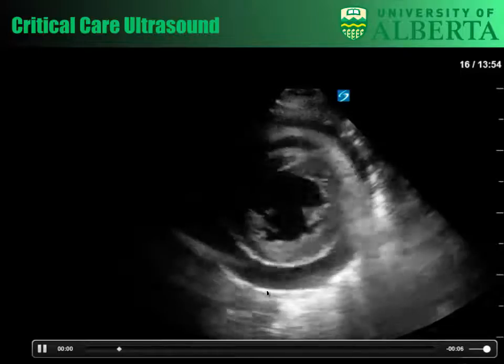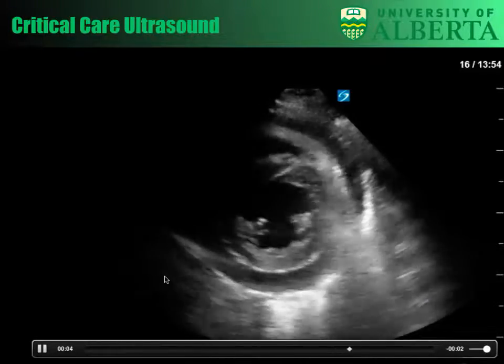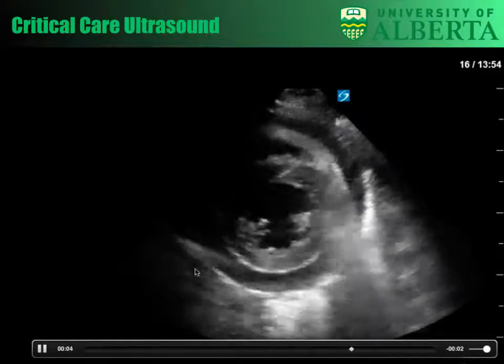Okay, even that alone is important information, because now we've seen it in 2 views. We've seen it go anterior to the thoracic aorta. Okay, based on this alone, this is certainly a pericardial effusion.